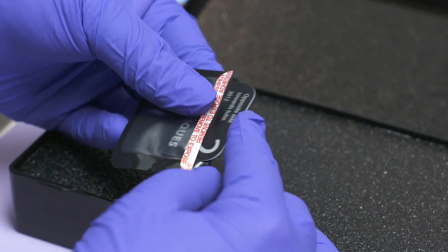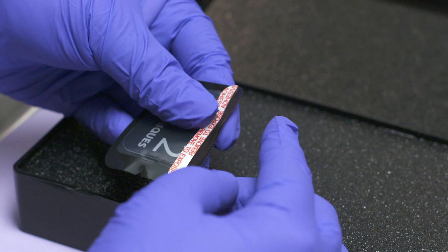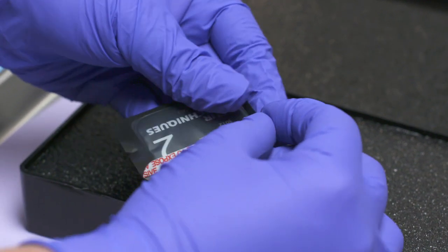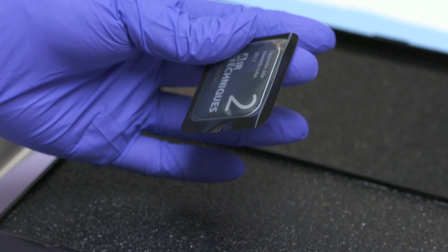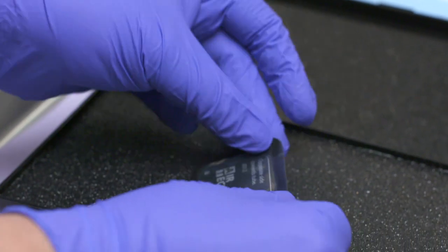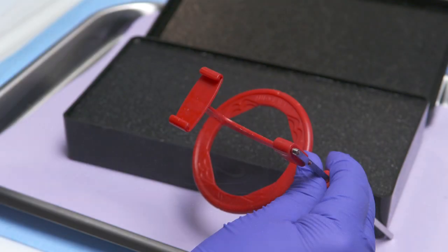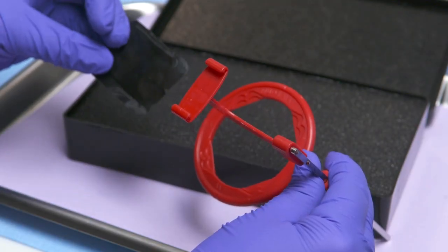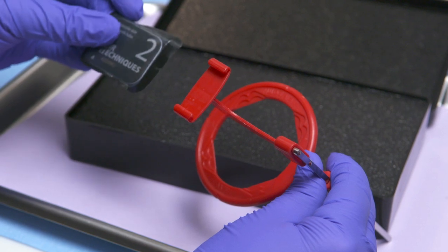With your gloves on, take the sensor and insert it into the barrier envelope with the printed side of the sensor visible. Peel off the adhesive strip and use your fingers to seal the envelope. Each sensor has a printed side and a blank side. It is important to ensure that the blank side faces the x-ray tube and is the side being exposed to radiation.